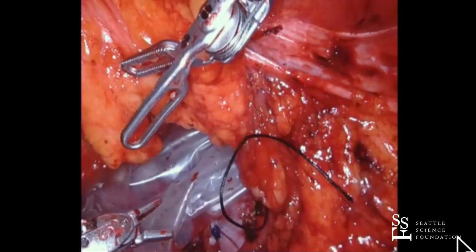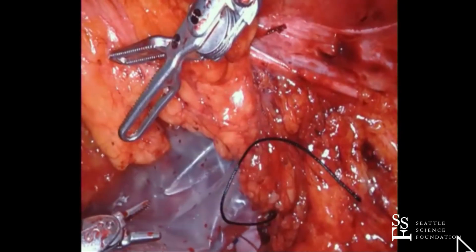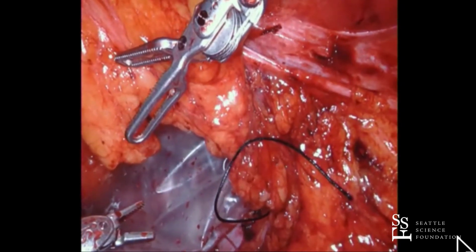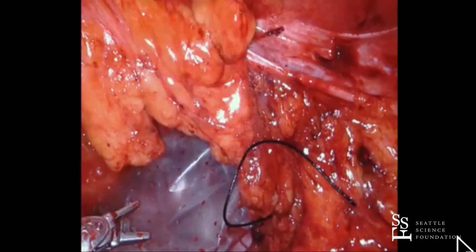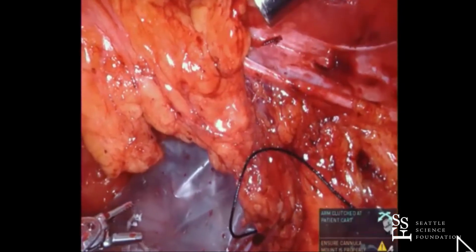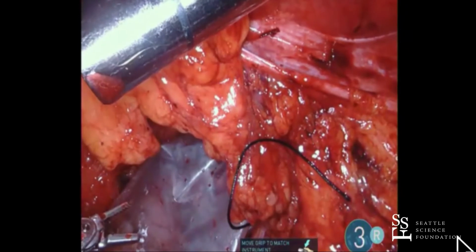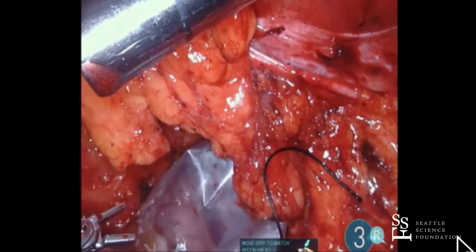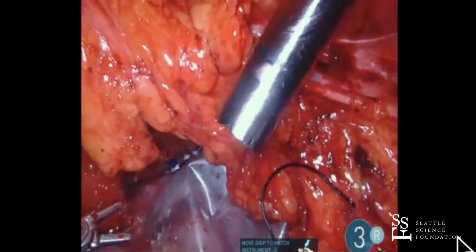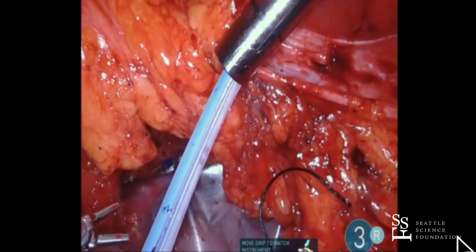So what I will do with the pathologist, and we might be able to show you this later, I serially section the tumor with the pathologist just to look at the deep margin. And I do that for a couple reasons. First of all, there's no discrepancy or concerns about getting surprised on the final pathology. If they call a negative margin here, I've never really had anybody say, oh, you've got a positive margin. So we go over it together. And we also get to inform our pathologists, and my pathologists are pretty experienced now. They're aware of the pseudocapsule. They're aware that that's not a positive margin. So that's something that's helpful.